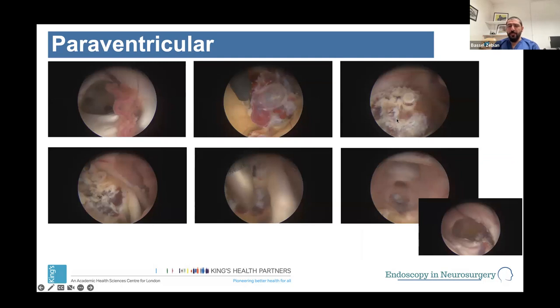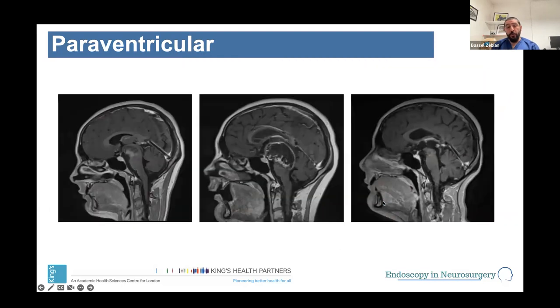The midbrain is relatively forgiving as long as the lesion or tumor is pointing towards the floor of the third ventricle. So we buzzed it, and we took out as much of the cavernoma as we could, but not all of it.